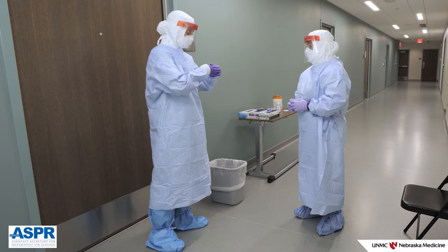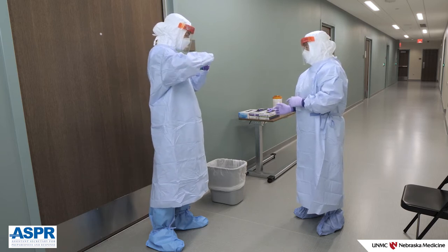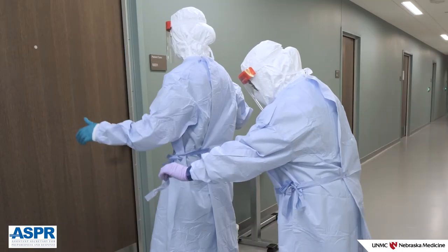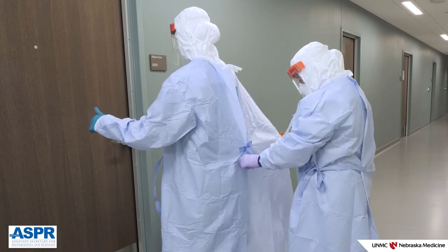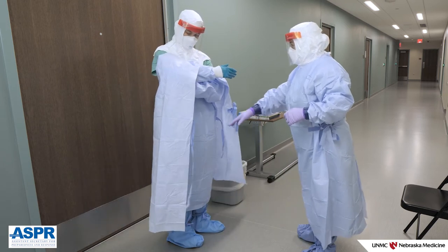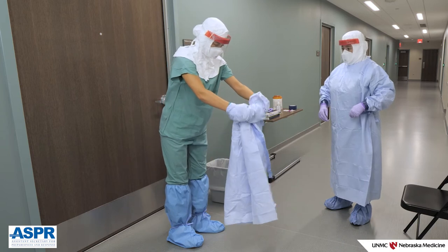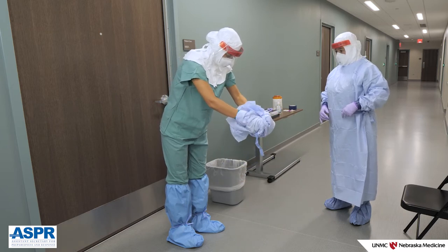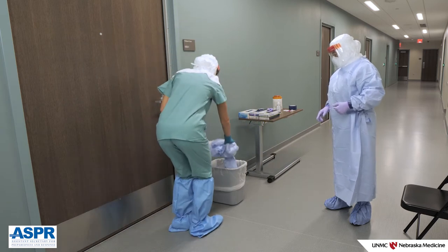Remove the long cuffed gloves using glove-in-glove technique. Your doffing partner will release the lower and upper gown ties and roll the shoulders of the gown forward. Grasp the gown just below the shoulder on the chest and roll the gown into a bundle so the soiled outside is contained within the roll. Lean slightly forward as you remove the gown to reduce potential contact with clean clothing. Once removed, carefully place the gown in the waste container.